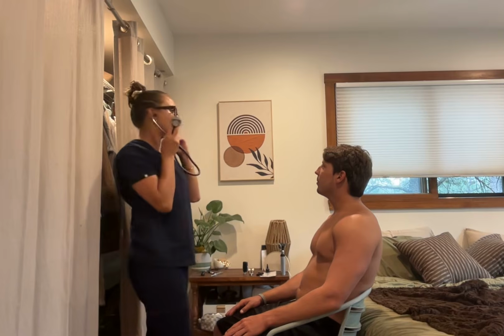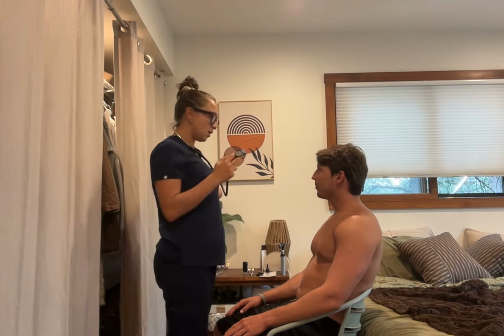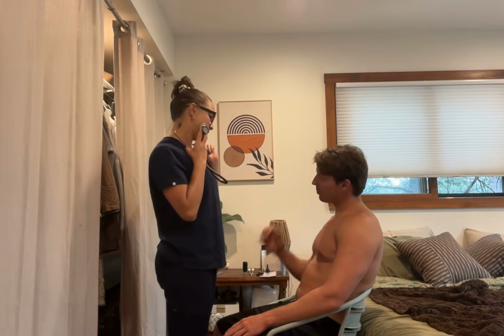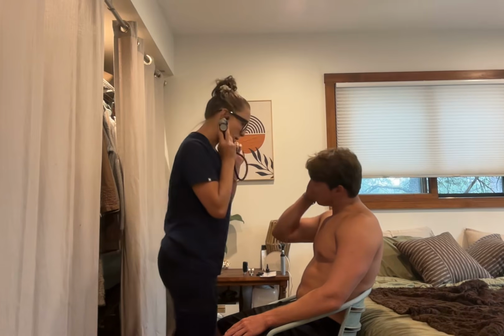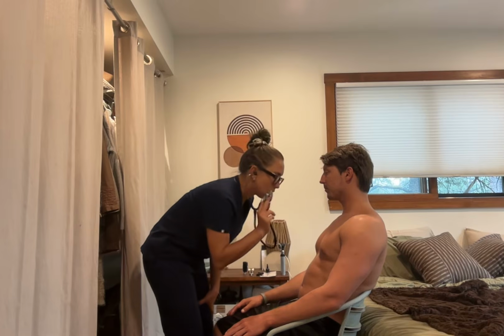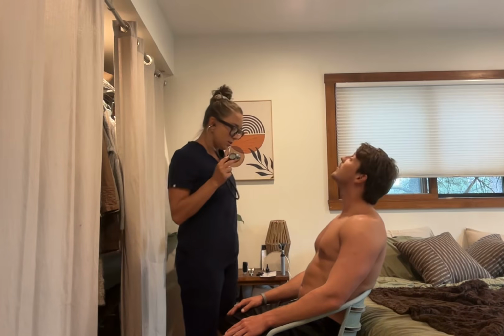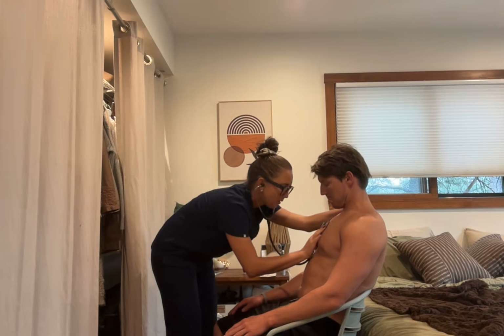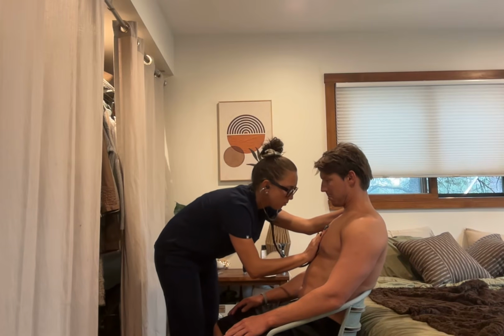Left lung sounds, 8 places on each quadrant, all clear, no adventitious breath sounds at all. Okay, now I'm going to auscultate your heart, starting with the diaphragm, and I'll start with the aortic valve. You could just breathe normal.